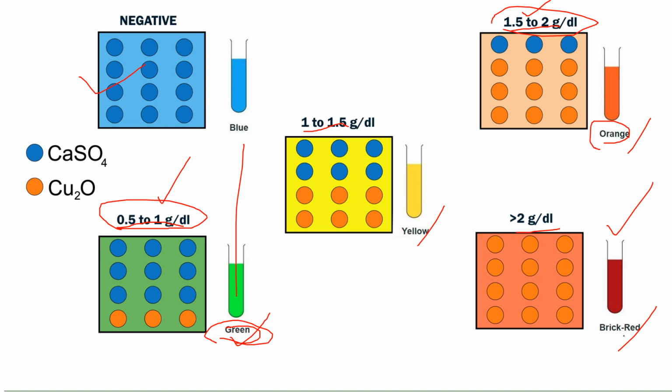So it is always very important, since it is a semi-quantitative test, the concentration of glucose is directly proportional to the Benedict solution. So if you add more urine or more Benedict solution, the test results can eventually alter. So that is why it is very important that we add only 5 ml of Benedict's reagent and 0.5 ml of urine.